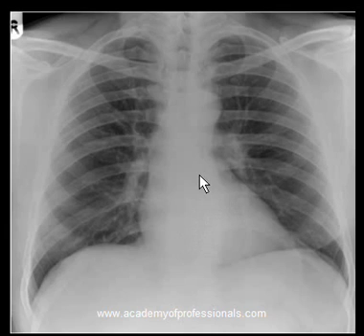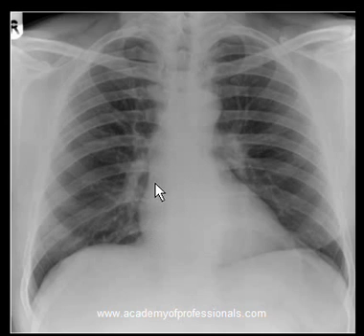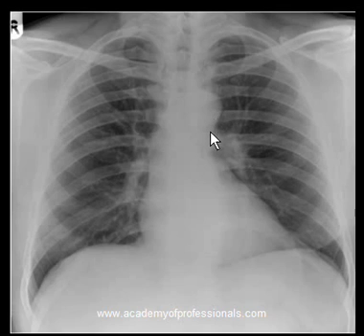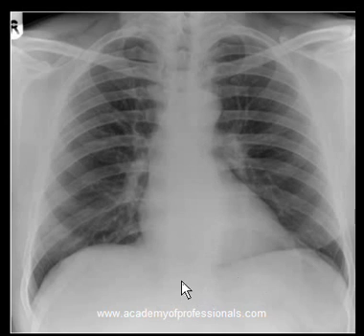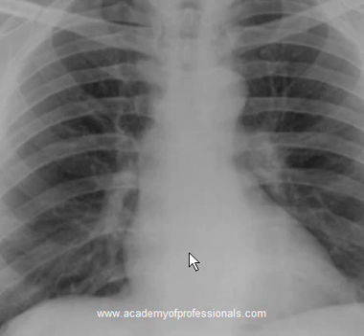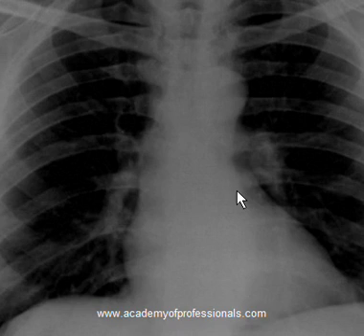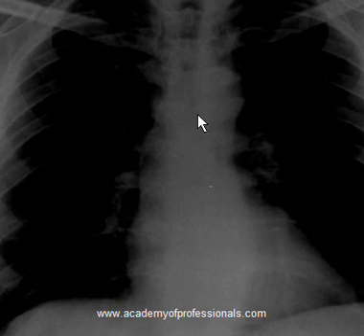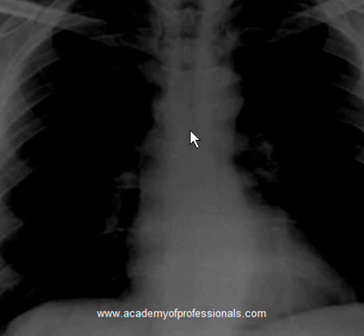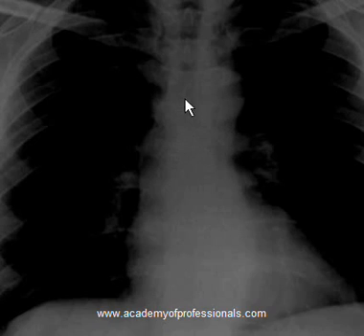So most of the x-rays you will see will show the ascending aorta here, the right atrium here, and then it moves up and diagonally back towards the posterior side, and the aorta runs down parallel with the thoracic spine. If you notice, the arch of the aorta pushes the trachea towards the right-hand side as it passes down, so above the carina the trachea will be pushed towards the right-hand side a little bit.